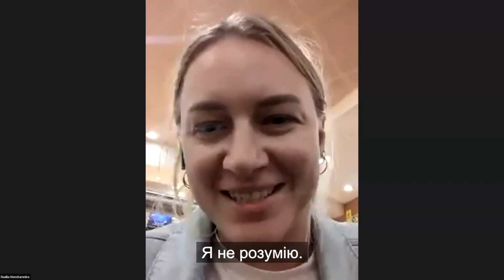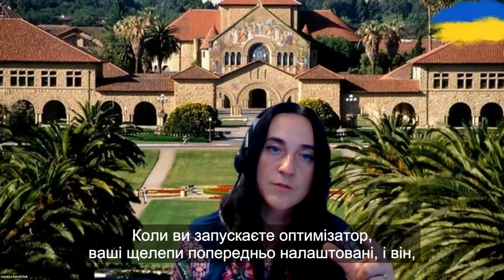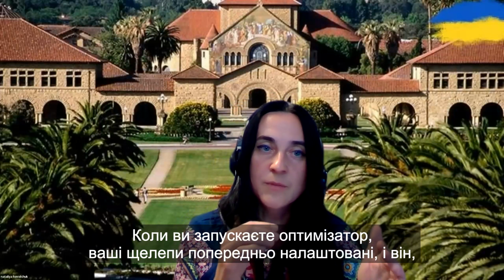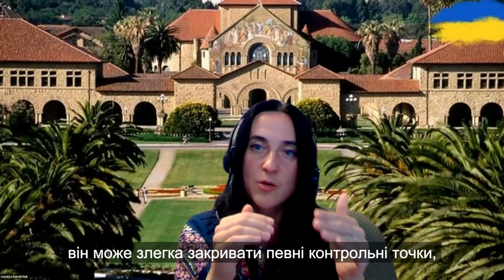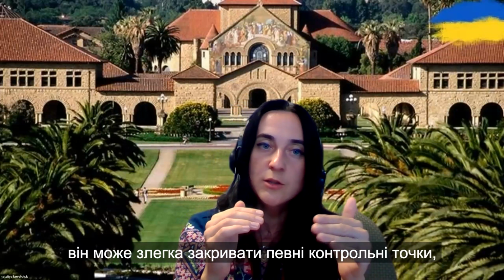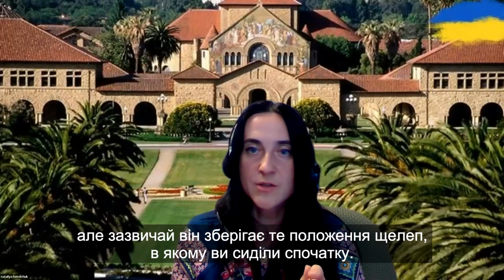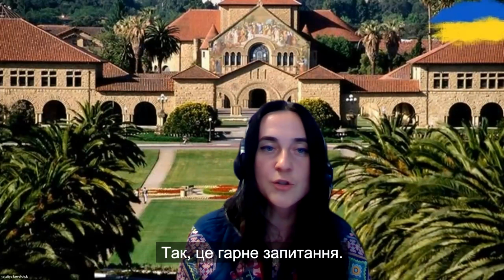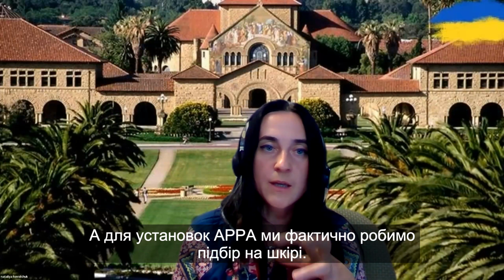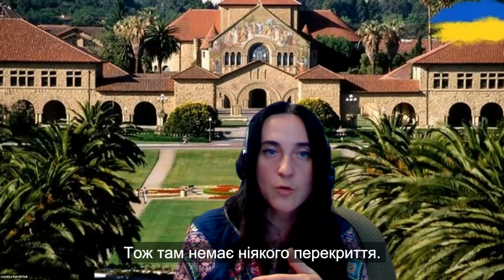I don't understand. Yeah, so it's controlled initially. When you start the optimizer, your jaws are preset, and it's typically using that jaw position. It might slightly close for certain control points, but typically keeps those jaw positions where you set initially. Okay. Thank you. Yeah, it's a good question. And for APPA plans, we actually do matching on skin, so there is no overlap there.